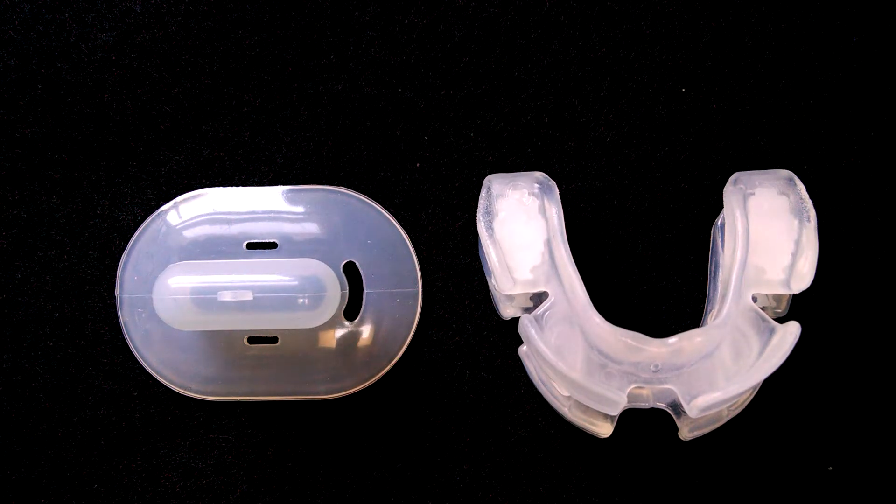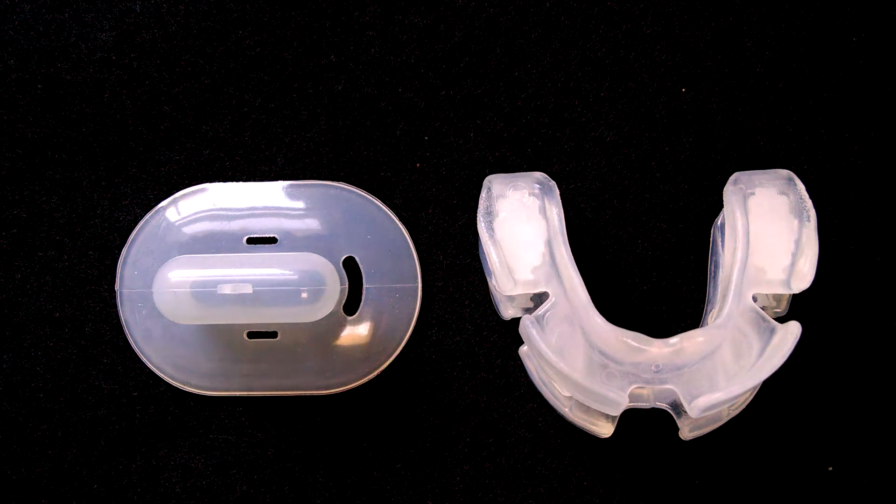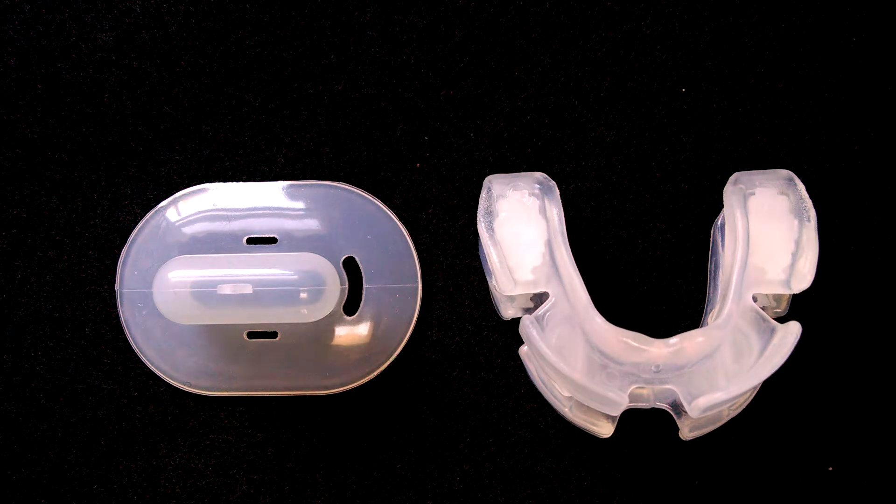Hey everyone, Bob Thomas from snorermouthpieceguide.com. Today I'm going to do a comparison video between the VitalSleep on the right and the Pacifier mouthpiece on the left. Now these two products are obviously very different, so I'm going to show you each one by itself and then we'll put the two side by side and compare the two.